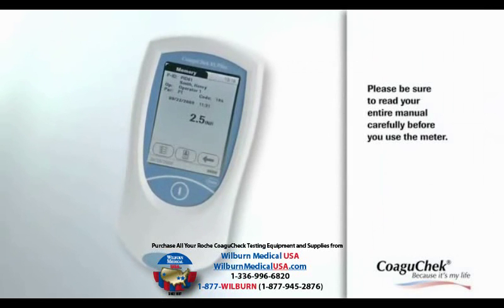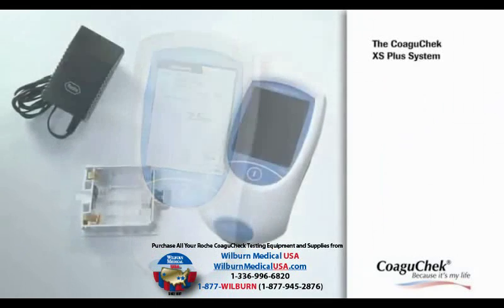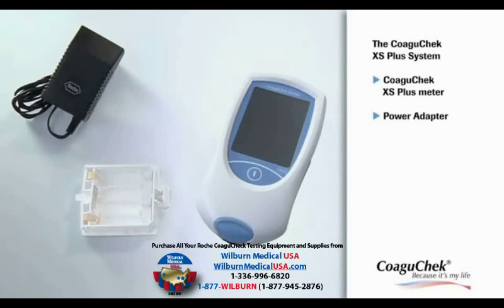Please be sure to read your entire manual carefully before you use the meter. You can use the Coagucheck XS Plus meter either with the power adapter or with batteries. The operator's manual gives you detailed information about the use of the meter. A CD-ROM contains the operator's manual in different languages.